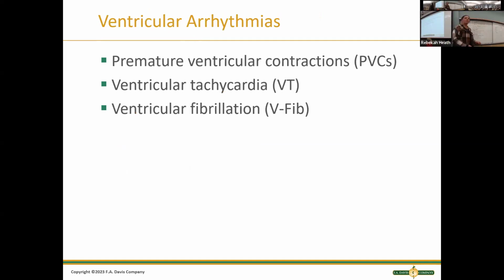Okay, so now we're going to talk about ventricular arrhythmias. We've been talking about atrial arrhythmia, so a beat that's coming from somewhere in the atrium. Now, these are beats that originate, or really start, in the ventricles. And remember, in the ventricles it takes longer for everything to move through than if it was sent from the sinus, and that's why you have the wider QRS complexes. So anytime you see a QRS complex that's not tidy, that's nice and wide, you're going to know, oh, that's from the ventricles. That's a ventricle rhythm.